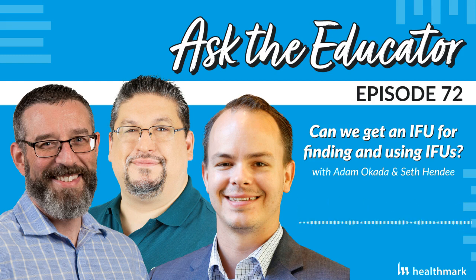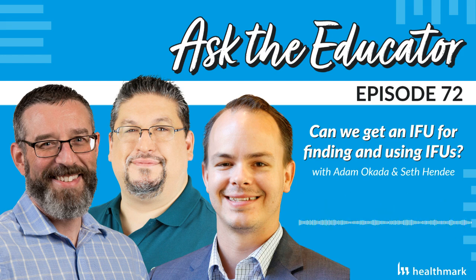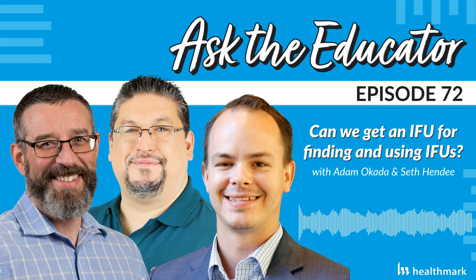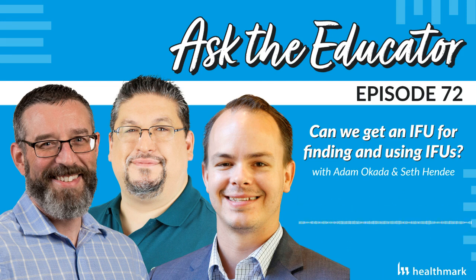Because that's when the surveyor comes in. They do want to know how you're doing things. That's always the first question, right? How do you process this? Yep. And then the second question is, how do you know that's how you process this? Right. And that is where the tech needs to be able to print or show that IFU to say, this is the reason why. That's a key step for a survey. And obviously, ongoing education and competency really do help with that.